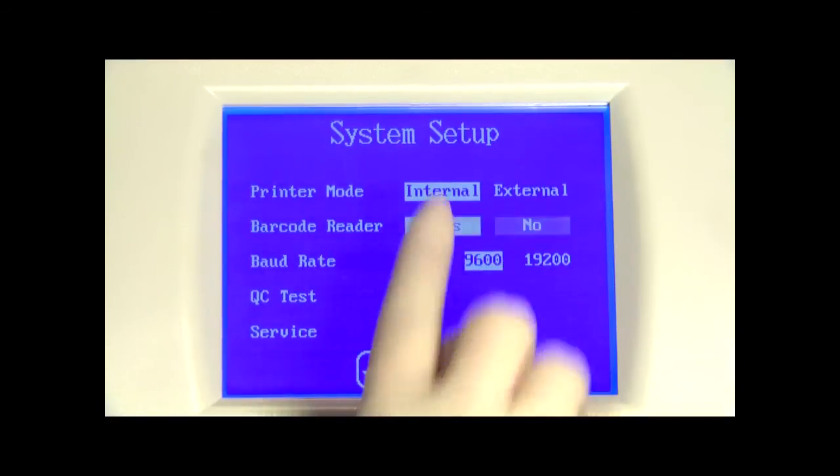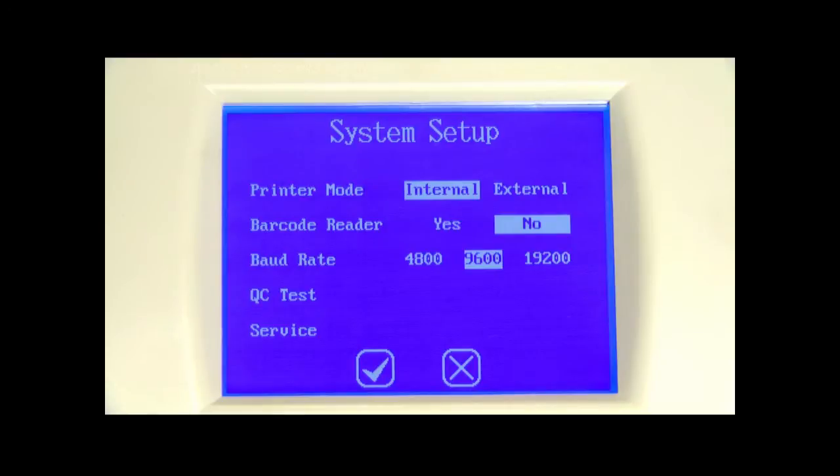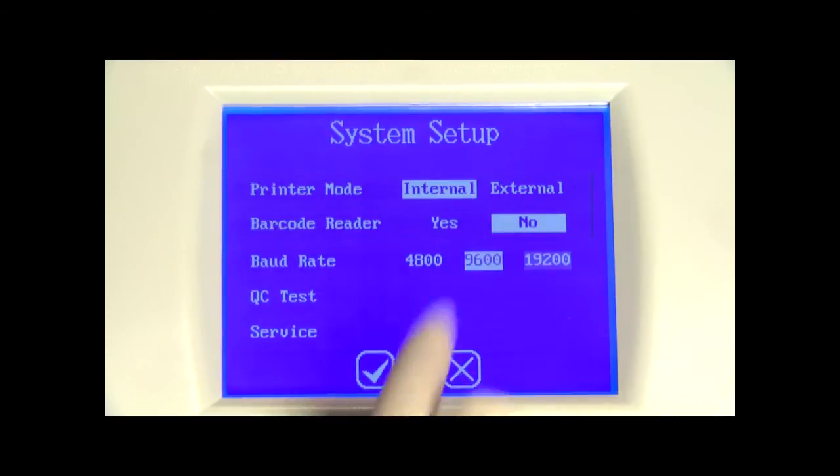For the barcode reader option, press barcode reader to highlight yes if the optional barcode reader is installed — screens will be modified to accept barcoded sample IDs. If the barcode reader is not installed, press barcode reader to highlight no. The baud rate is the communication speed for the RS-232C port used with the barcode reader or external computer. All devices connected to the RS-232C port must be configured for the same baud rate — the default for the barcode reader is 9600. Press baud rate to cycle through the options and leave the desired rate highlighted.